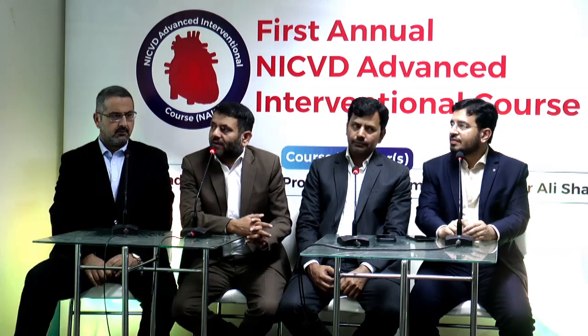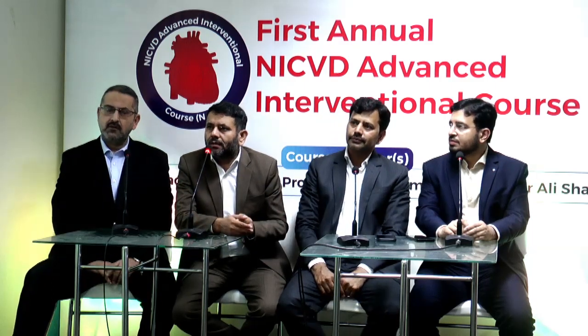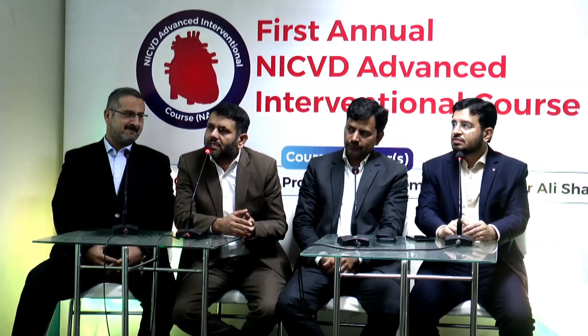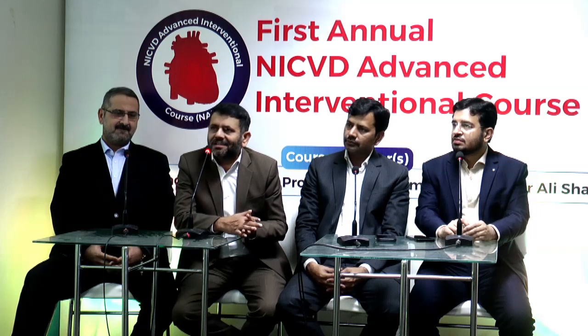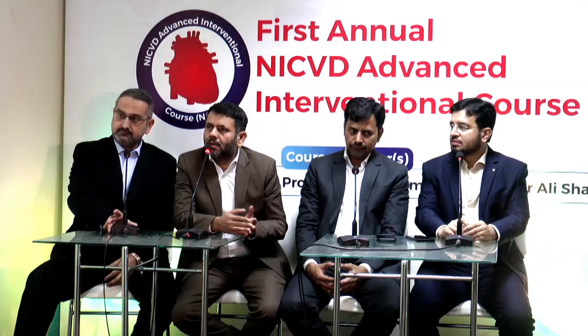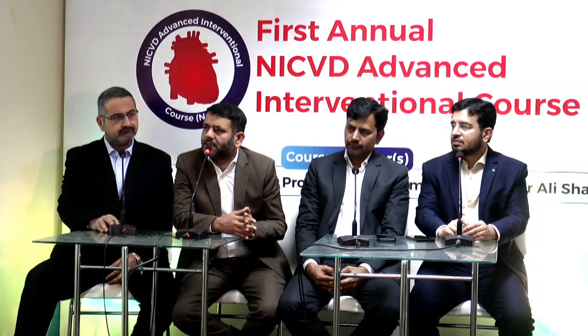I totally disagree with Dr. Ammar, because for graft intervention of the SVG, which patient goes for redo and which patient goes for PCI? These patients have a good EF, SVG to LAD, and other SVGs occluded. No LIMA, it is already harvested. You didn't see the LIMA, Jahangir. So I would go for PCI of the SVG to LAD, but with preparation, because it's the only artery the patient is on. So you can put in an IABP and have backup support with anesthetists. You can go for the PCI to SVG to LAD.